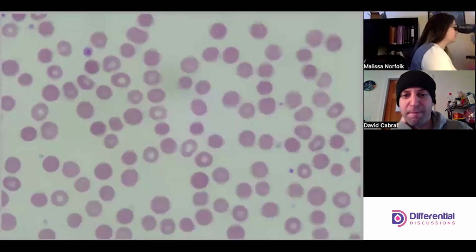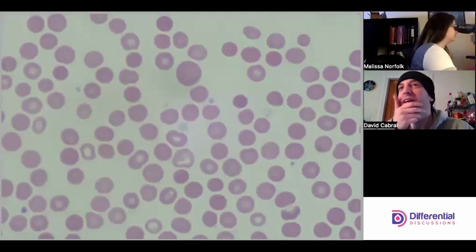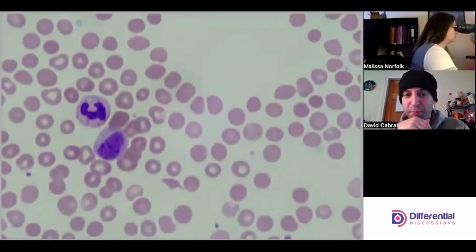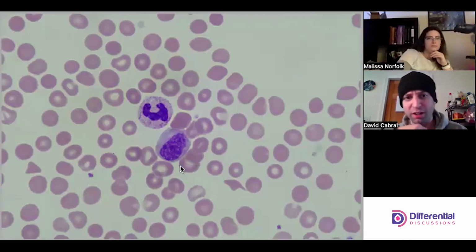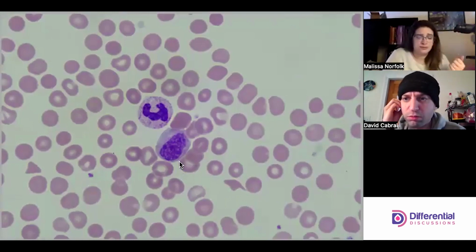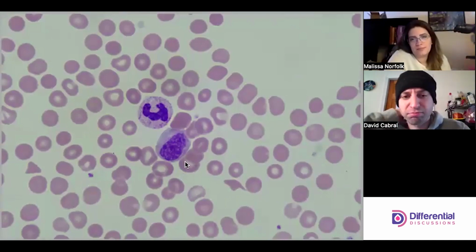Just look at the size of this red cell here. Every now and then we encounter this, usually in a patient that has received a transfusion. Perfect. So we see a myelo or meta, depending on how you want to stage this. This is a really good immature granulocyte. I'd probably go with a meta, because you get the flat side, and the chromatin pattern is more mature.